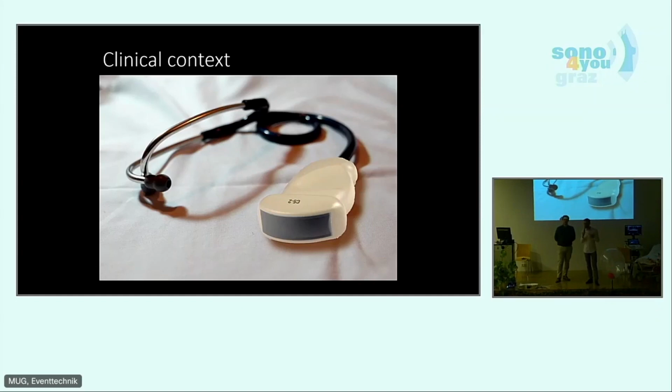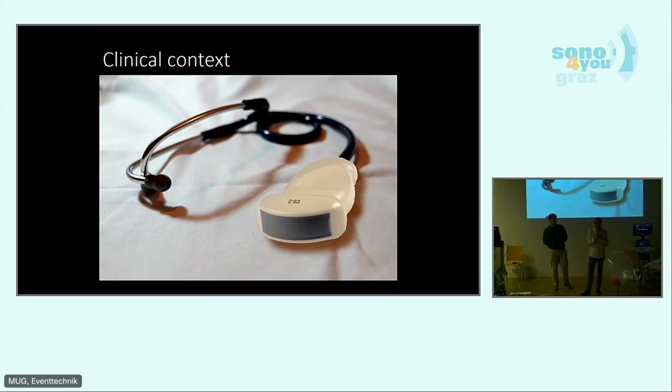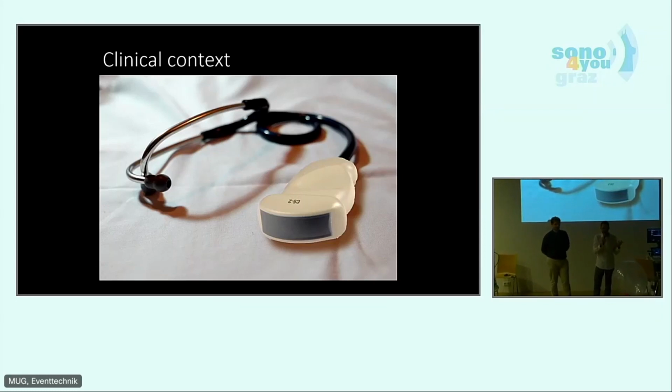This has also been mentioned before as point of care focused ultrasound. So is there liquid? Yes or no? Is there a stone? Yes or no? And then there is also another concept we want to bring you. In our last part, it's the 5 Ps that Gregor Brosen brought in a few years ago at this event.